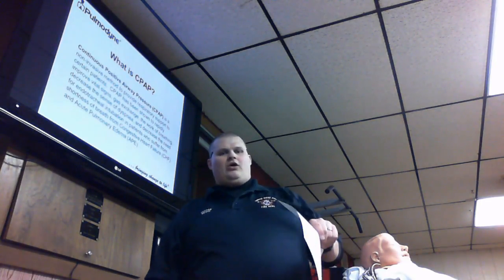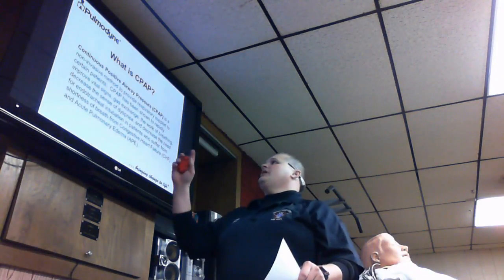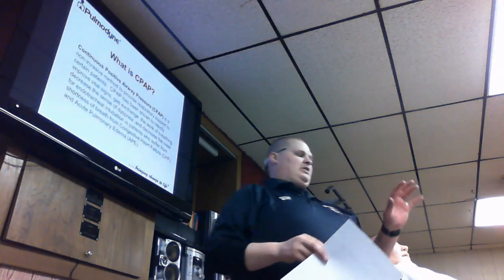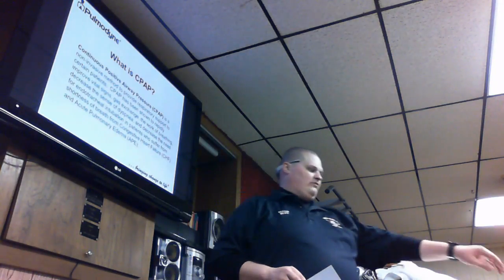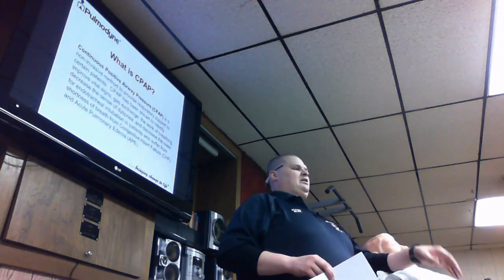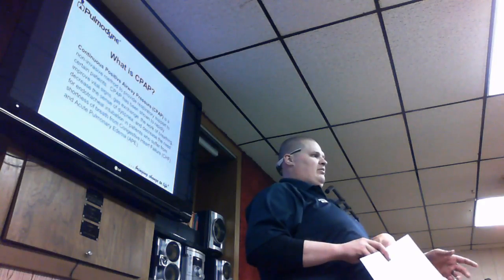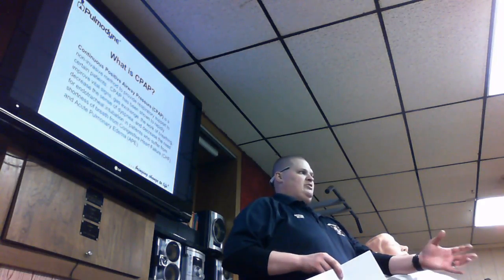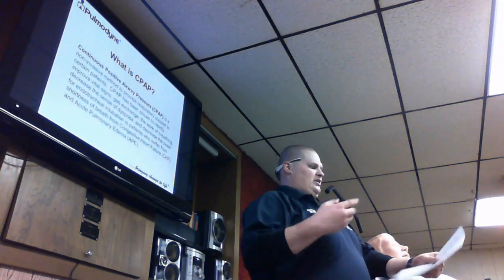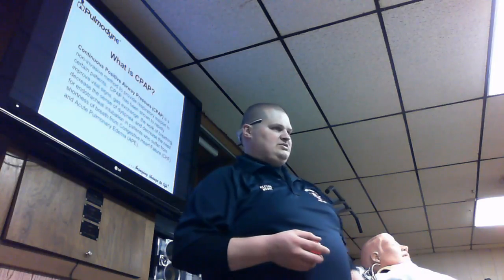By the way, before I go on, this PowerPoint was provided by Pulmodyne. This is the company we use for all of our CPAP products. They have a few things that are a little different from what we operate off of. Remember, we operate off of Nebraska protocols, but CPAP is used throughout the country, and their contraindications and indications are pretty much the same as ours.